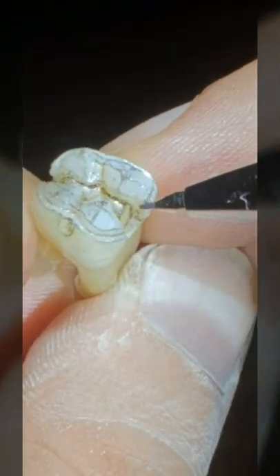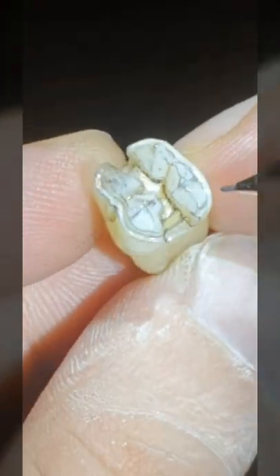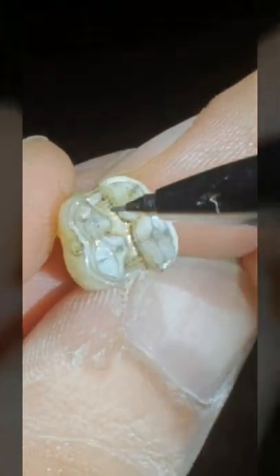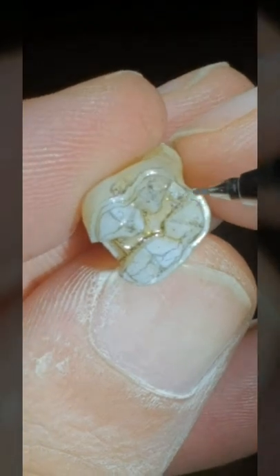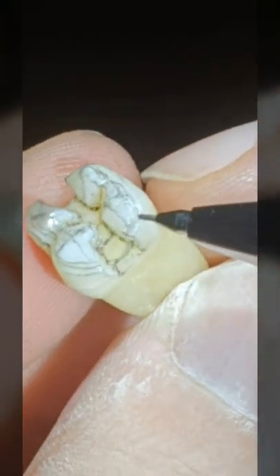Plus on the distal you have 2, then you have the boxes. So 16 facets on the lingual 2 cusp and 16 on the facial 2 cusp. You have 32 facets total that you're supposed to recreate. Plus then you have the margin, which is even all around, and the margin must continue into the box in order to gain the full strength.